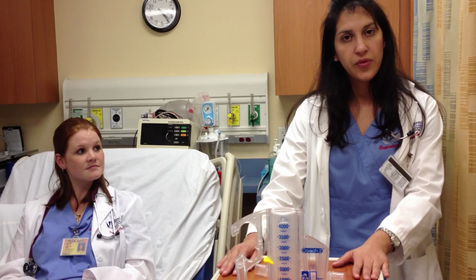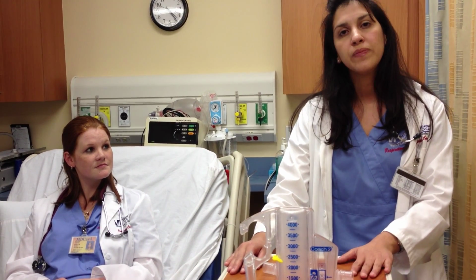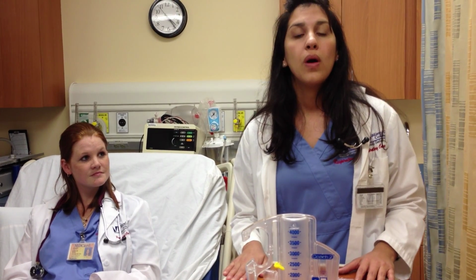Now that I have reviewed my chart for the indications of the breathing device called incentive spirometry, I am going to go in, introduce myself, identify my patient, wash my hands, and put on gloves.